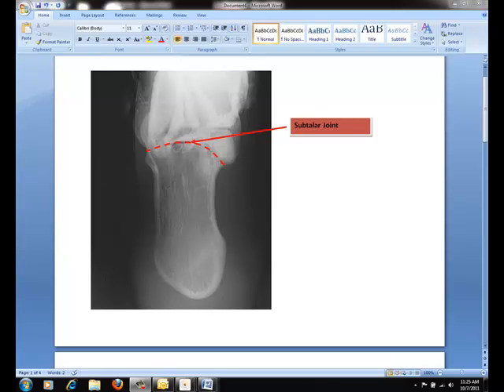There should be no rotation of the calcaneus. This can be seen by making sure the first or fifth metatarsals are not projected to the sides of the foot. In addition, the anterior portion of the calcaneus should be seen without excessive density over the posterior portion.